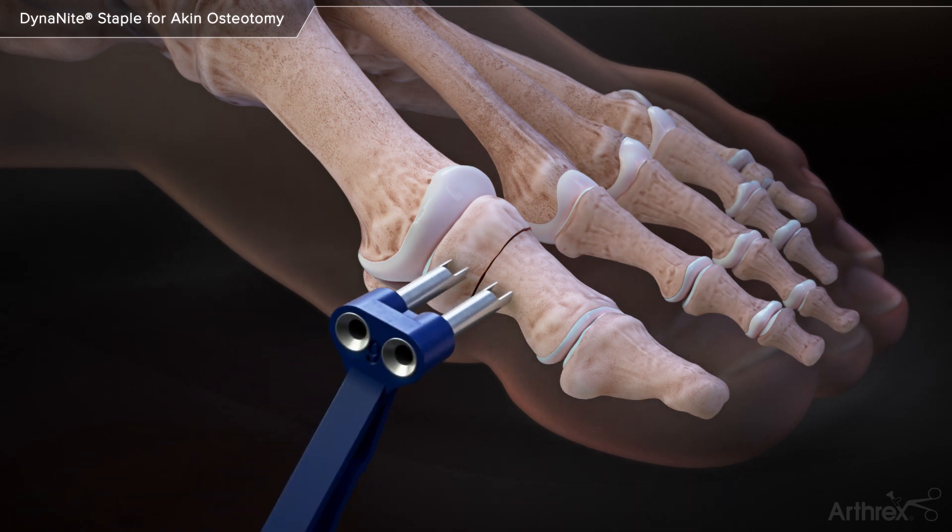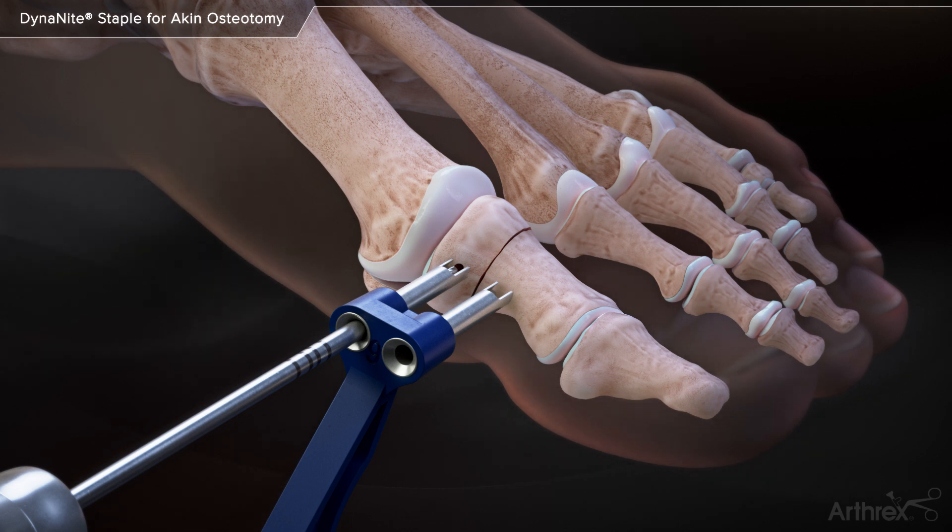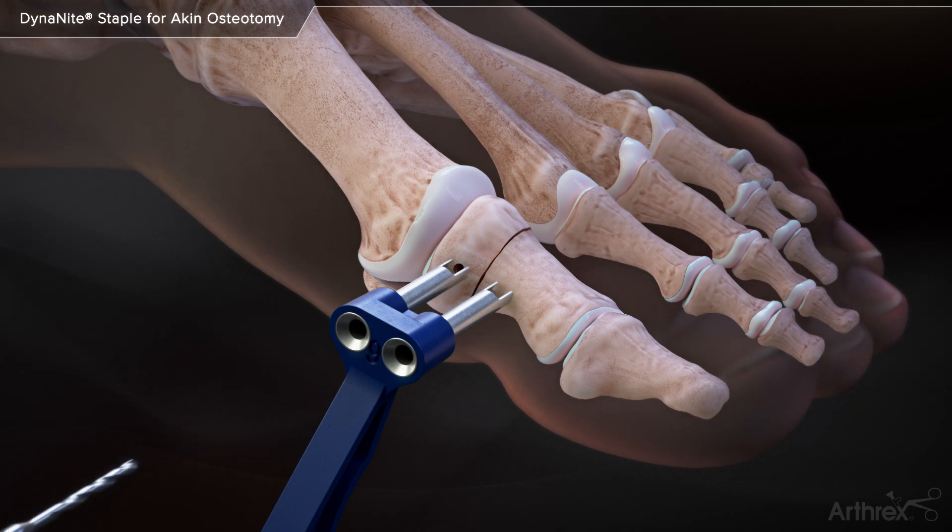The Dynanite Drill Guide is centered across the osteotomy site. A 1.6mm Dynanite drill bit is used to drill the first hole in the proximal portion of the osteotomy site. The drill bit is laser marked to help drill to the correct depth.